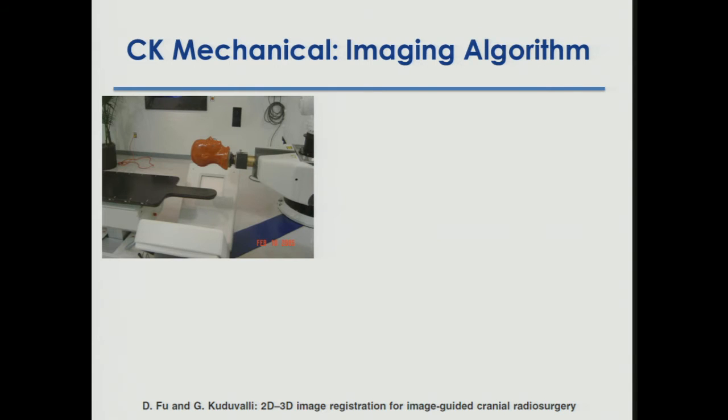So next up, we're testing the imaging algorithm. And this time I flipped it. I start with the CyberKnife first because it's the easiest. If you set up the patient on the table, we have another part of uncertainty coming in. We're now not just setting up a patient in a frame anymore. If you go frameless, you're using an algorithm to compare your patient position to the CT.